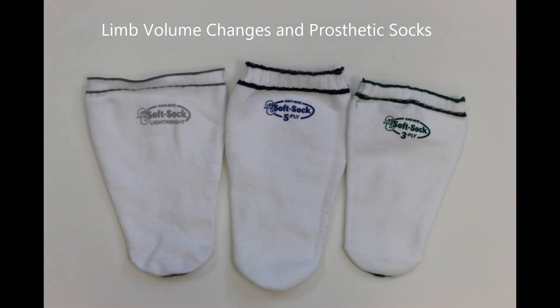While using a prosthesis, your limb can change sizes throughout the day. Over time, the limb also tends to decrease in size as muscle and tissue mass decrease. Prosthetic socks are used to maintain a proper fit in your prosthetic and account for the changes in limb size that occur. Socks come in one, three, and five ply. The term ply represents how thick the sock is and how much space it will take up.